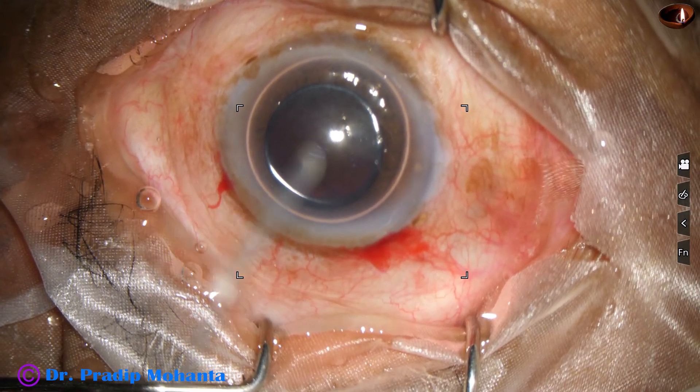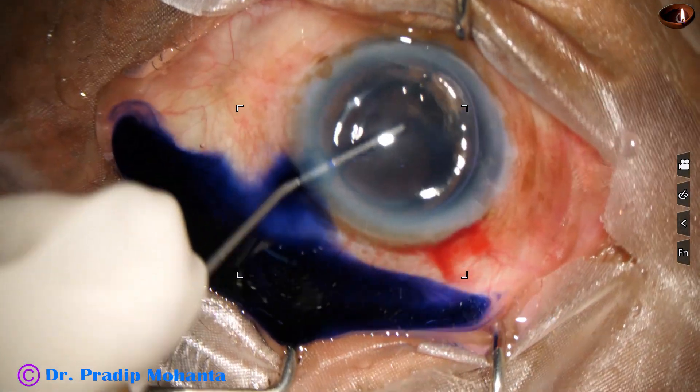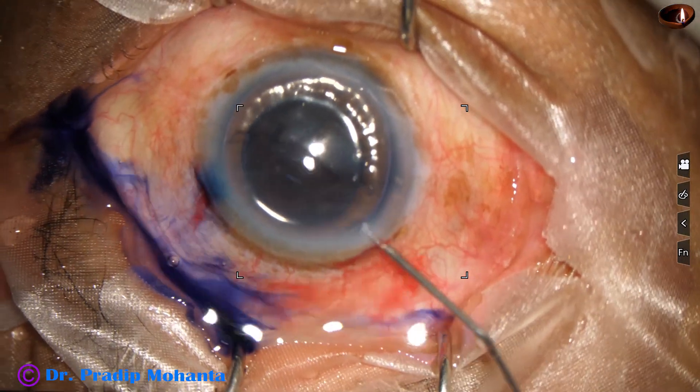An air bubble is injected. Beneath this air bubble, trypan blue dye is applied over the anterior capsule. The dye should touch all parts of the capsule.